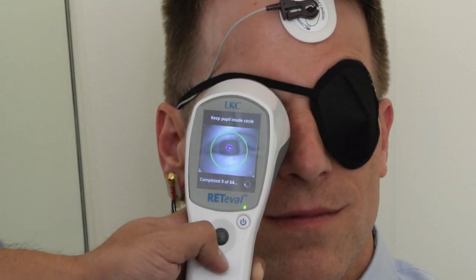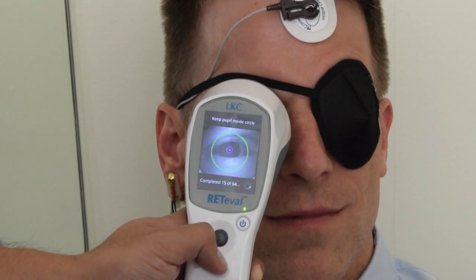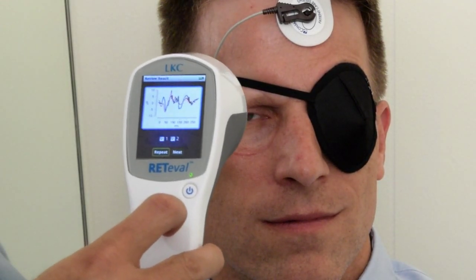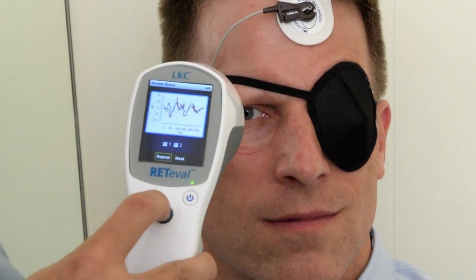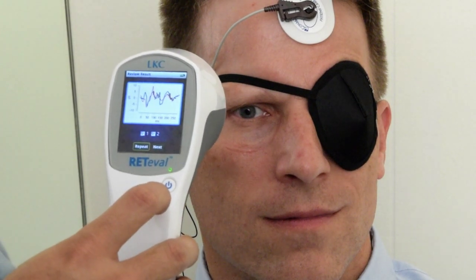During the actual test, you can inform the patient of their progression and how much they have left for the test. You can repeat the step as many times as you'd like and you can toggle between which sweeps you would like to keep. After you have finished testing the right eye, click on next to move on to the left eye and repeat the same process. Do at least one duplicate for the left eye as well. Once you have finished testing, the device will save the results.